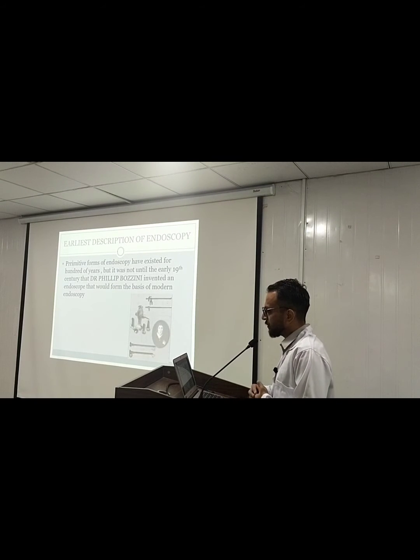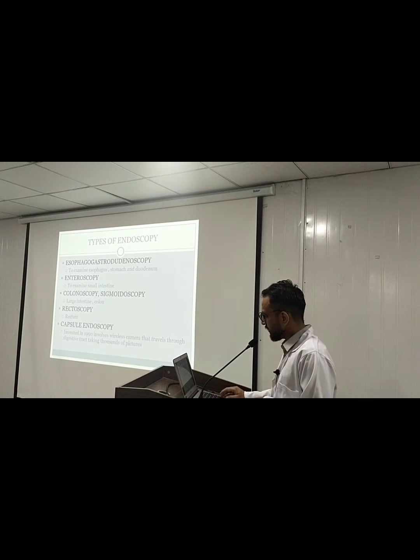The earliest description of endoscopy, what is the history of endoscopy? Primitive forms of endoscopy have existed for hundreds of years, but it was not until the early 19th century that Dr. Philip Bozzini invented an endoscope that would form the basis of modern endoscopy. So this was the earliest invention of endoscopy, and this was the instrument that was used before as an endoscope.